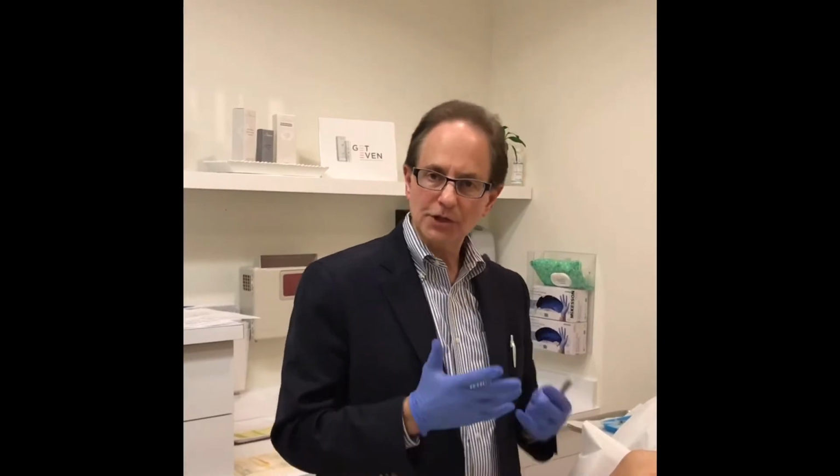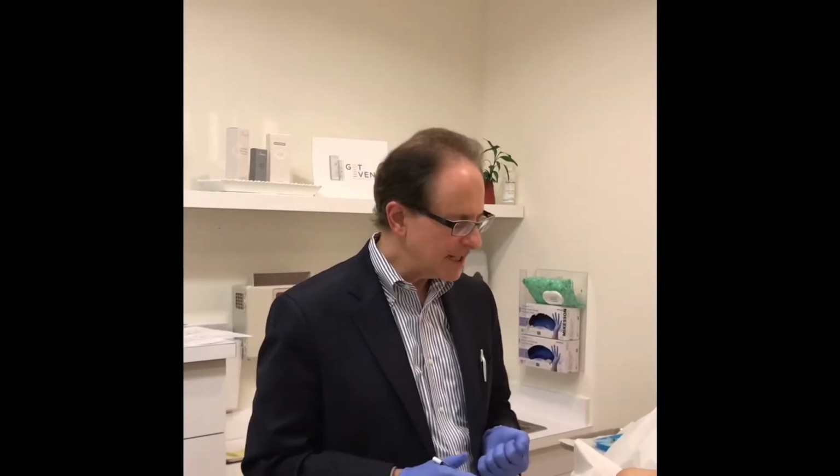Sculptra is polylactic acid, a milk sugar that is used for volumizing the skin. It's been used successfully in volumizing the chest area due to changes that have been induced by aging, the weight of the breasts, and environmental pollution. Today we're going to do an injection with diluted Sculptra that's appropriately diluted for the chest area.